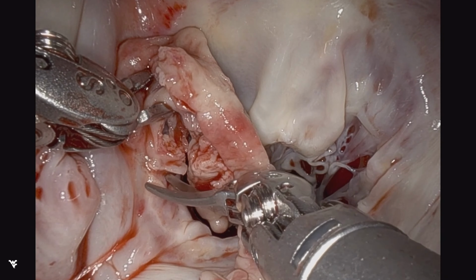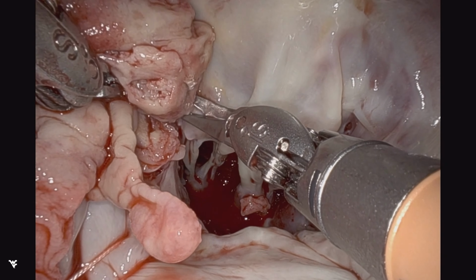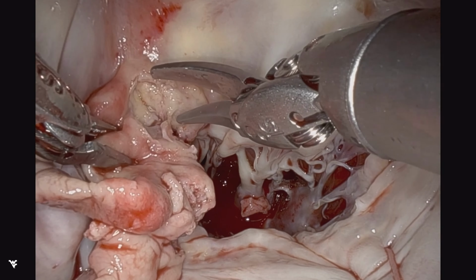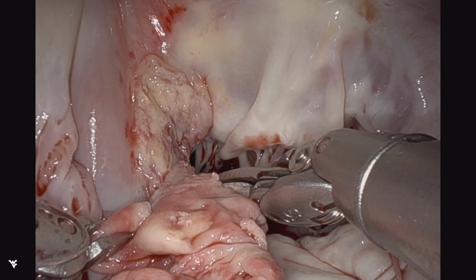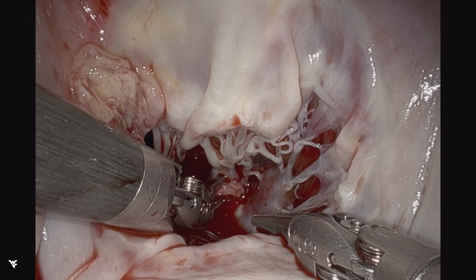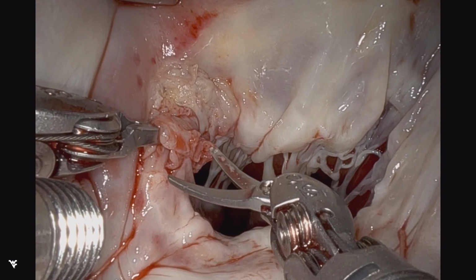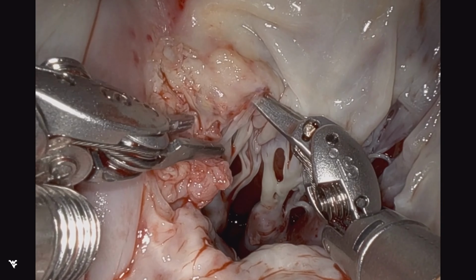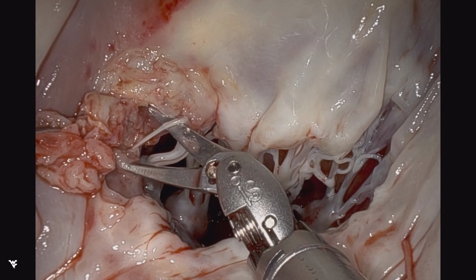So the first step, as always, is a full and complete thorough debridement of any and all devitalized tissue. So the perforated leaflet tissue and acute vegetation was excised. And it doesn't stop there, as one looks like there is most of the vegetation gone, but as we saw on the transesophageal echo, there was some subvalvular component. So we elected to continue and noted that there was an abscess cavity that we're unroofing right now.